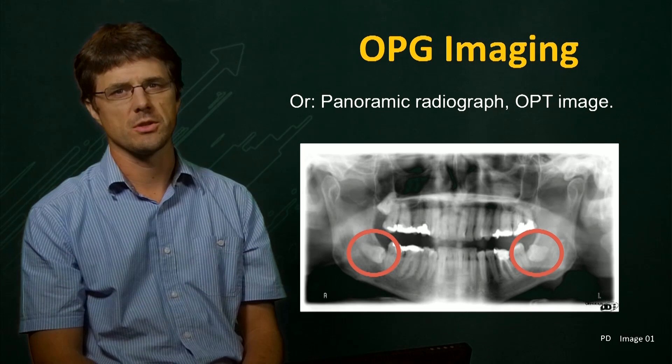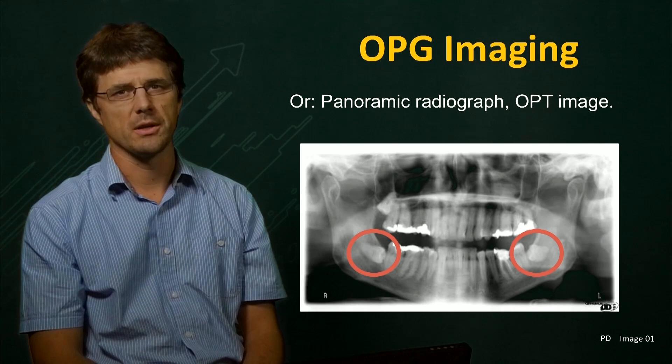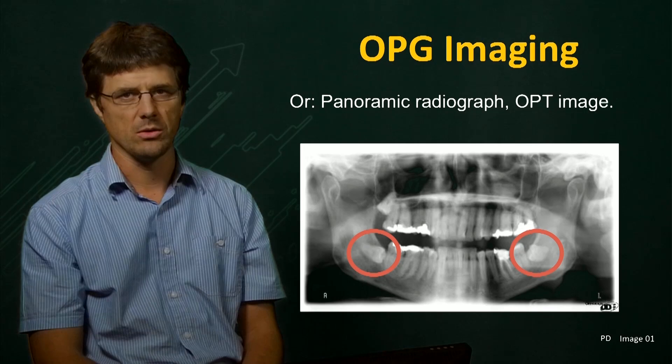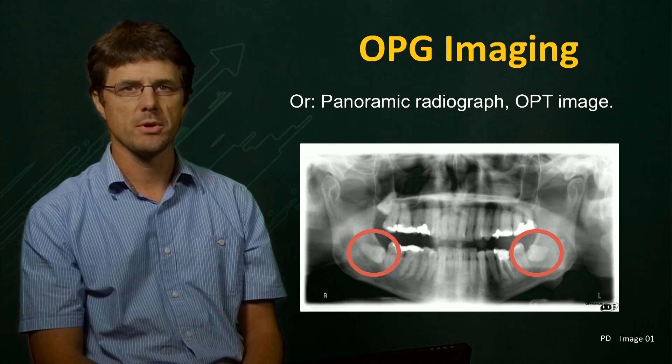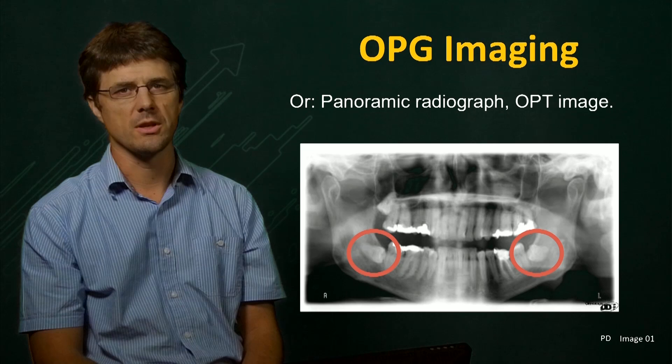Note that the mandibular structures and teeth are well defined while the background features such as the skull largely have reduced clarity. This is made possible by the acquisition methods used in OPG.